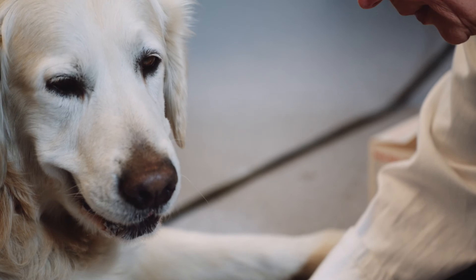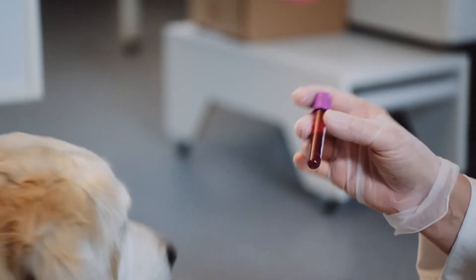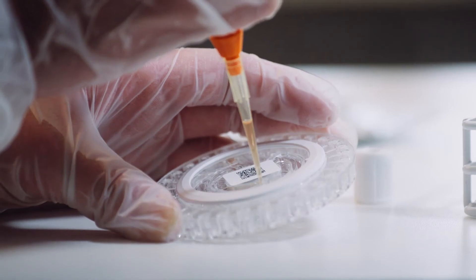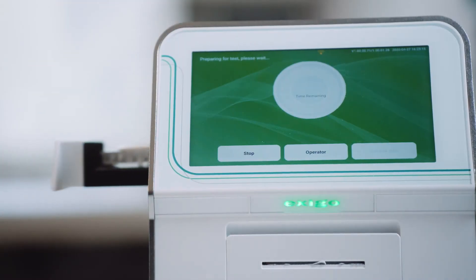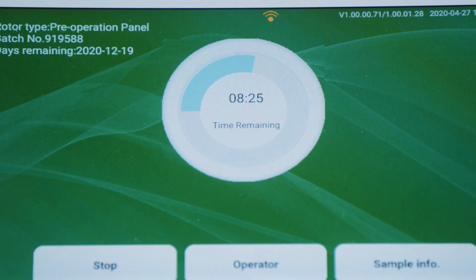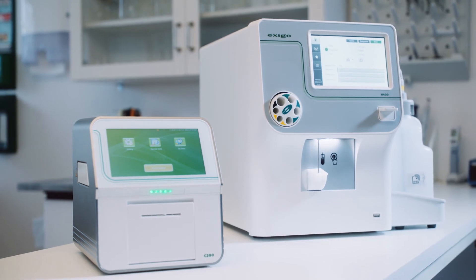Only three simple steps are required for an analysis. Take the blood sample and insert the sample material of choice — serum, plasma, or whole blood — into the rotor of choice. Insert the rotor into the analyzer. Read the results, less than 12 minutes later. Sampling and analyzing patients should be simple and effective.